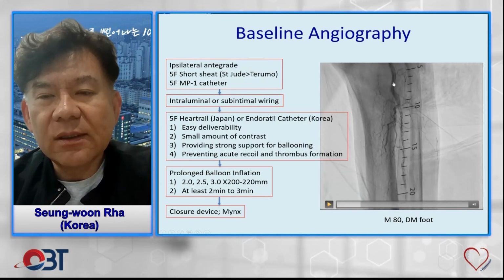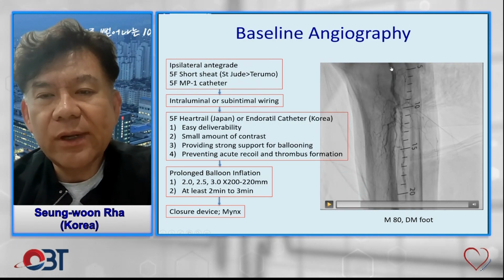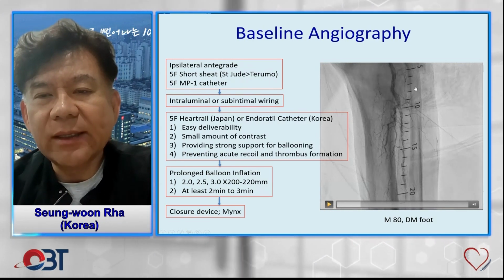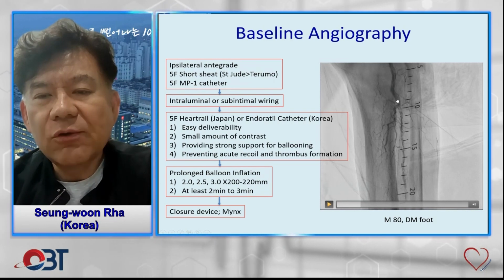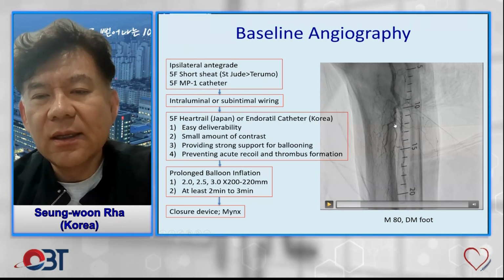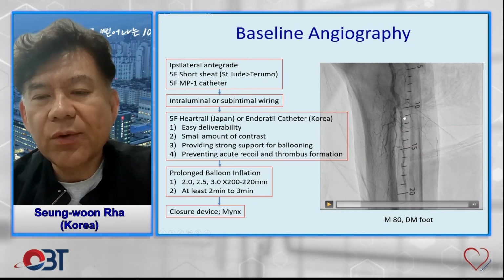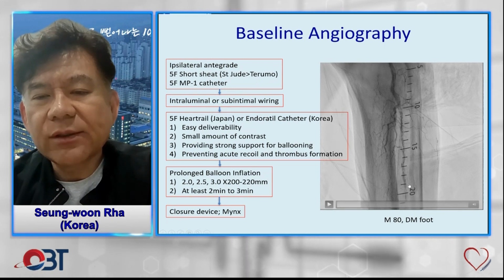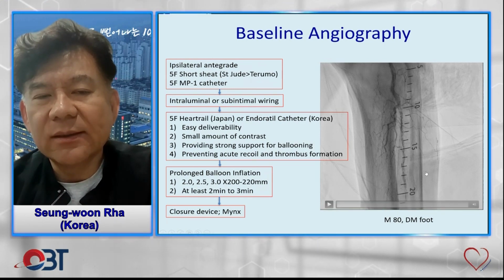However, you can be suspicious of this angulated area. There may be some area of initiation point of ATA, some suspicious area of the starting point of PTA at this angulated portion. Only the peroneal remained, but the mid portion is a total occlusion. Some collaterals remained, but nothing else remained.